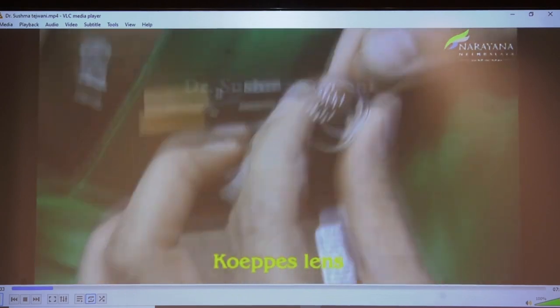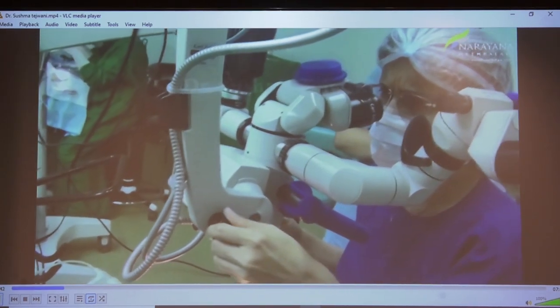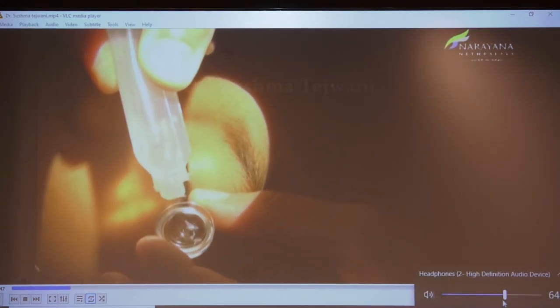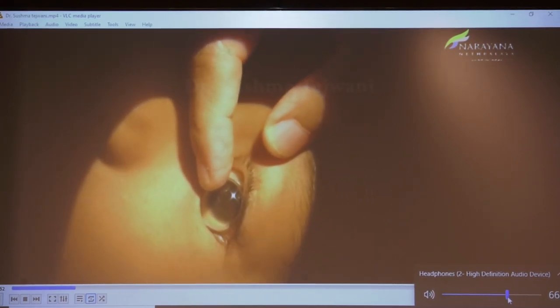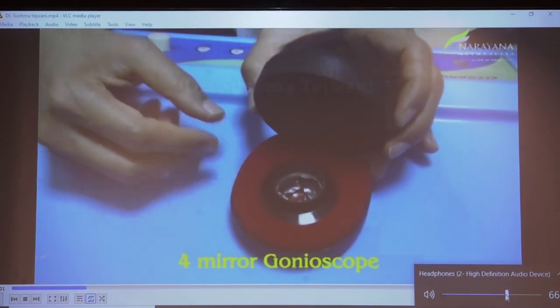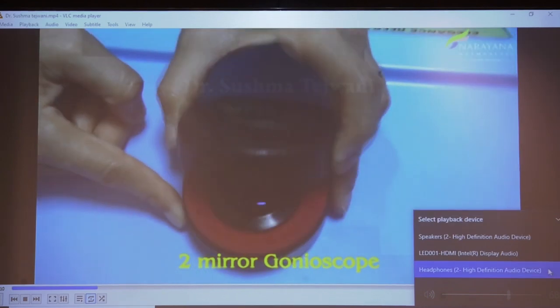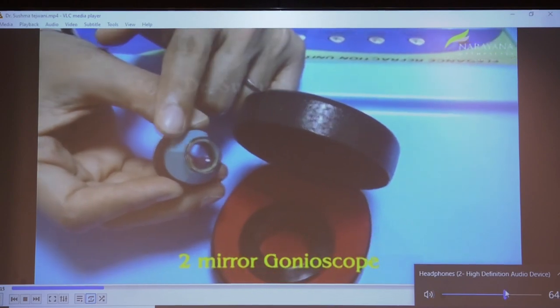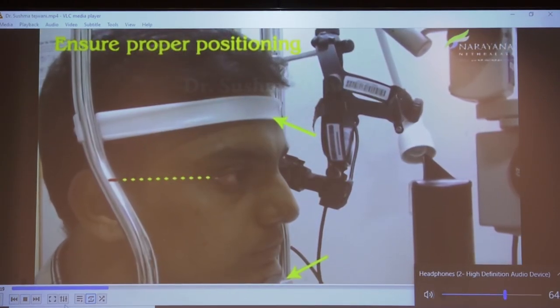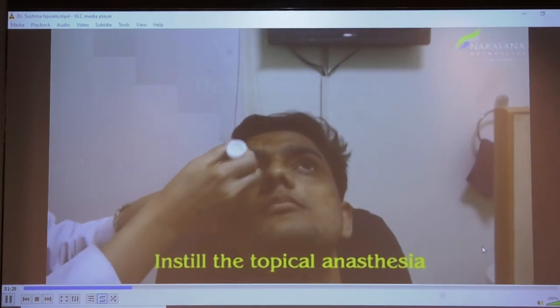This is how a Koppe's lens looks. It is used for gonioscopy in a supine position, especially for children under general anesthesia. Change to the slanting position by moving the knob, the concave part of the lens is filled with saline, and inserted onto the eye. The angle is then examined directly. The most commonly used lens for indirect gonioscopy is the 4-mirror, which has a contact surface smaller than the corneal diameter. The 2-mirror lens has a concave surface larger than the corneal diameter.